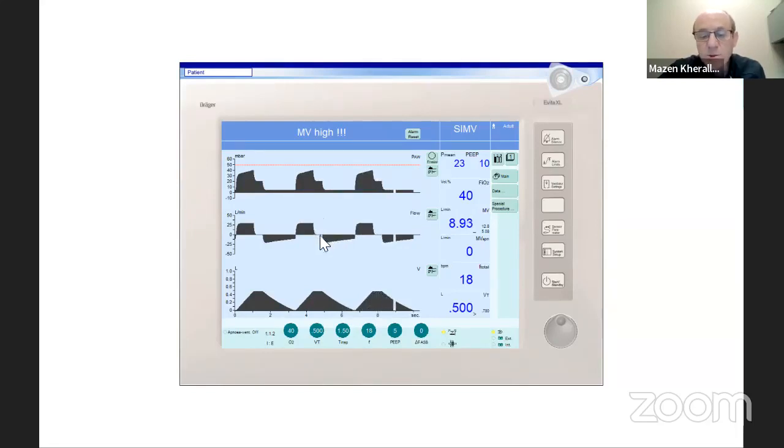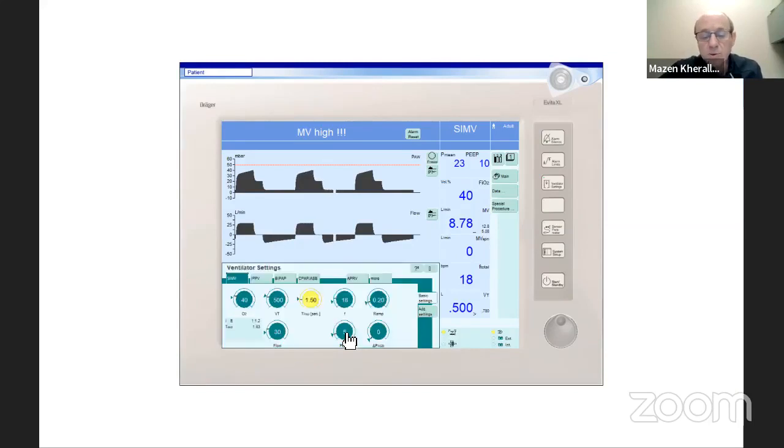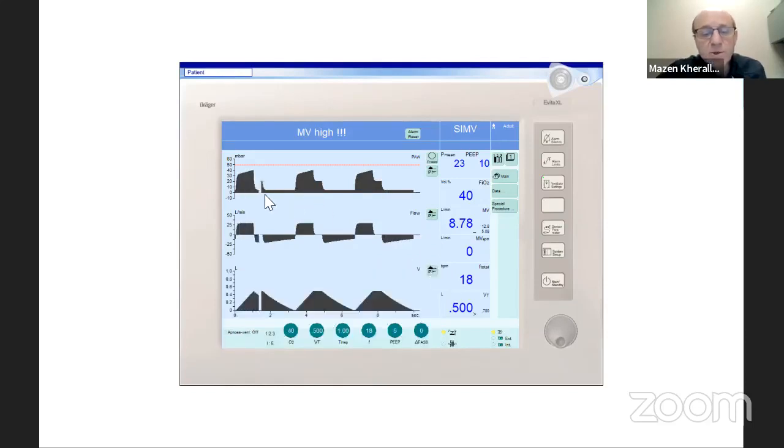So the first thing you do is get rid of that inspiratory time here and give it to expiration. This way, you would prolong expiratory time without affecting the minute ventilation, right? Yes. Okay, so that's the first thing that we do. So I'm going to go down on inspiratory time, where I would have no plateau at all.